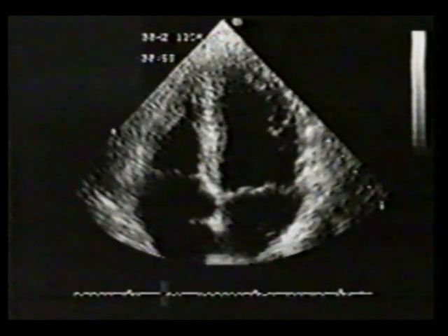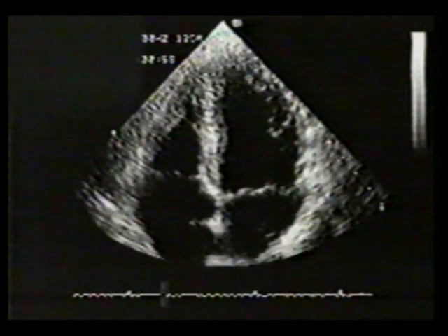We will continue the two-dimensional examination by moving the transducer to the cardiac apex. The ultrasound beam is oriented along the long axis of the ventricles such that a 4-chamber view is obtained. This is a systolic still frame.